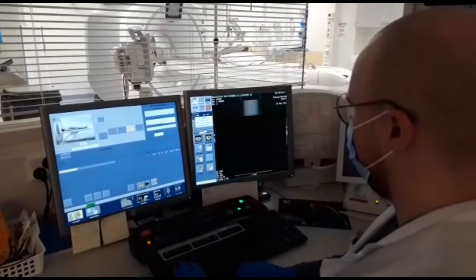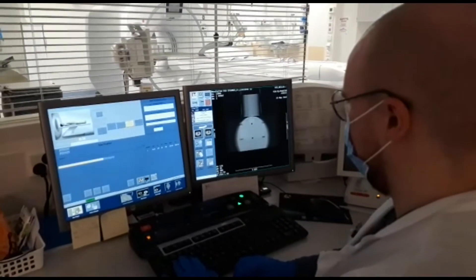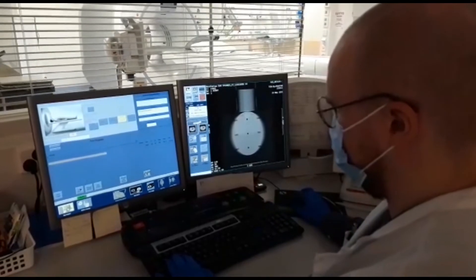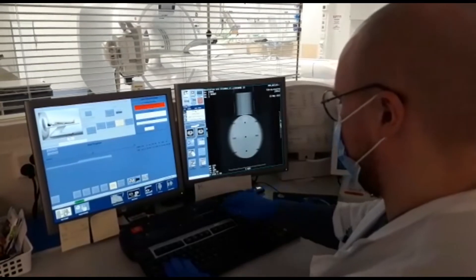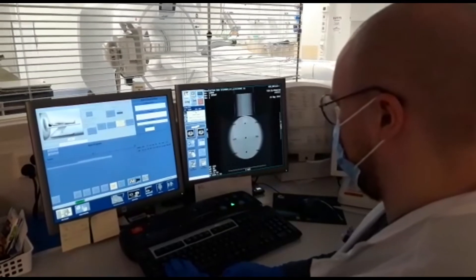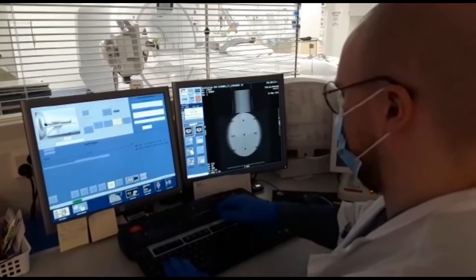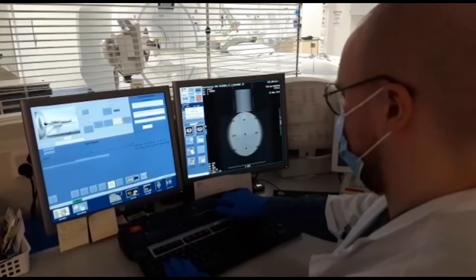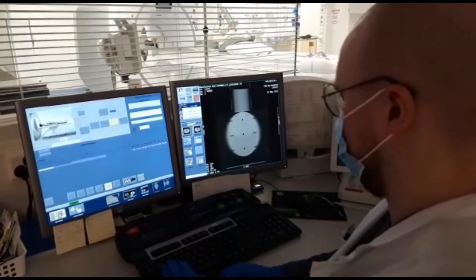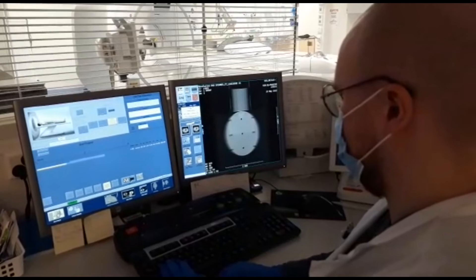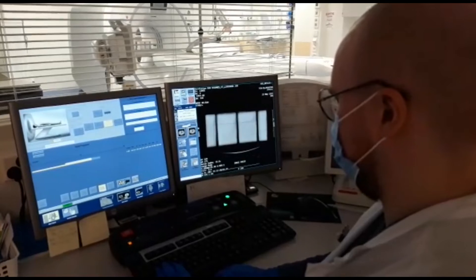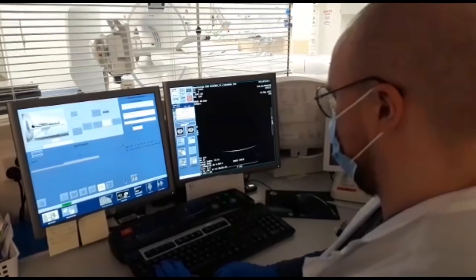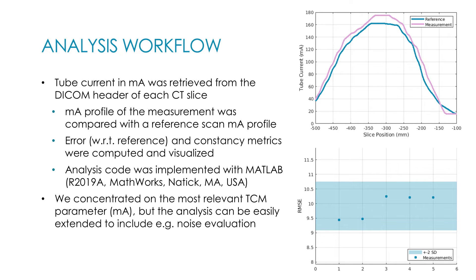First the scout image is taken, and finally the actual CT scan is taken. And that's all. The data can be sent to a processing server directly from the scanner or retrieved from a PACS for analysis.